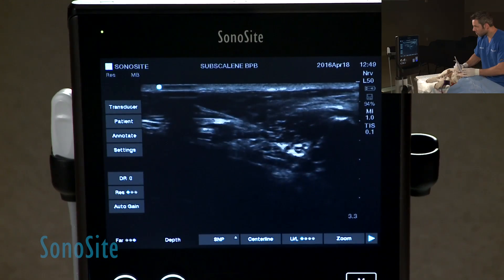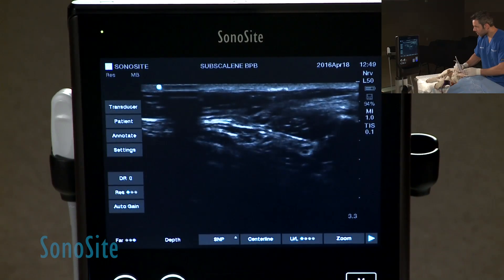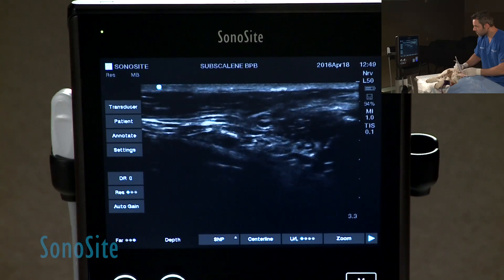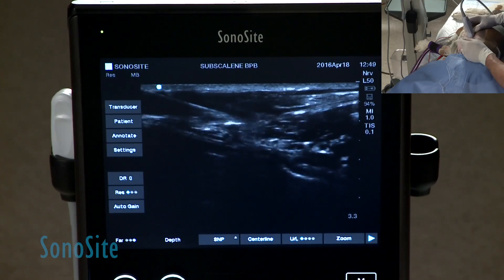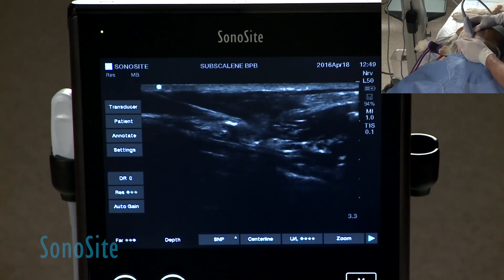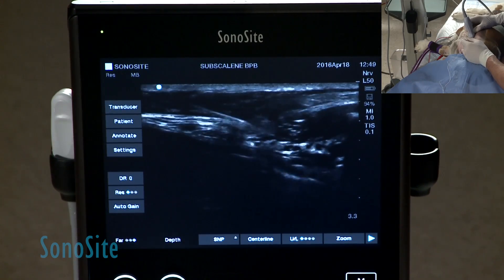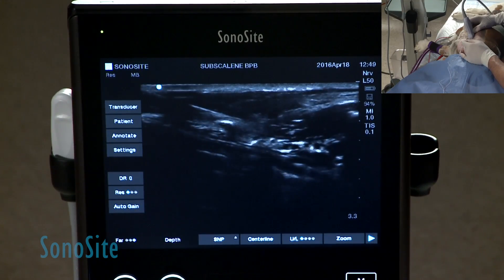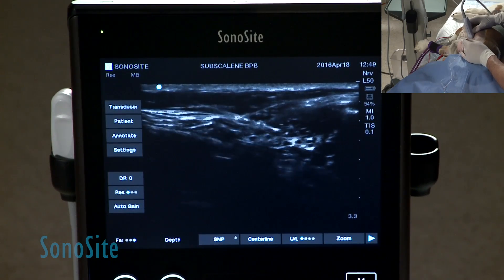After I do an injection here, I'm going to move a little bit cranially, and you can see that the contraction of the limb will change because now I'm going to a different root and different nerves. I will be trying to coat most of these nerve roots. This is a great technique and a good alternative for the axillary area because you have less branching of these roots. Dr. Pablo Otero did this description. I find it much easier for making sure you have a complete block. However, it's a much more skill-dependent block and can be quite tricky due to the proximity to major vessels and the trachea.